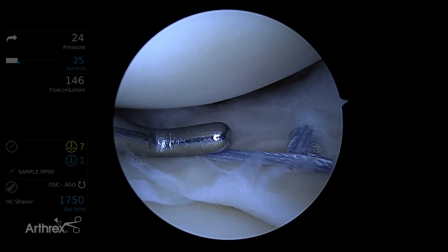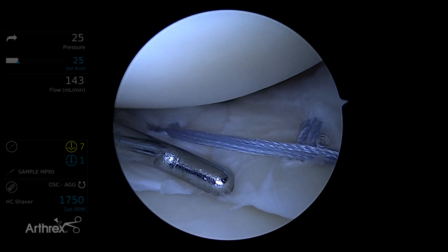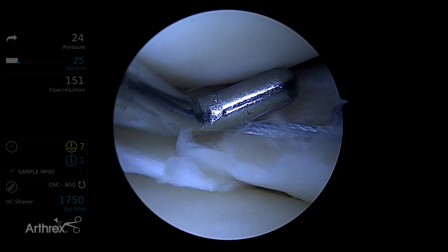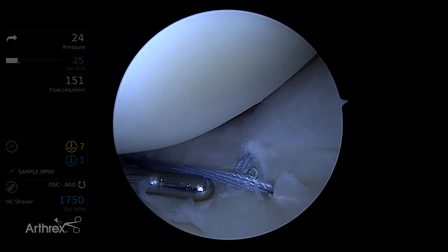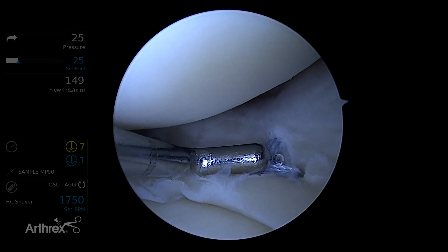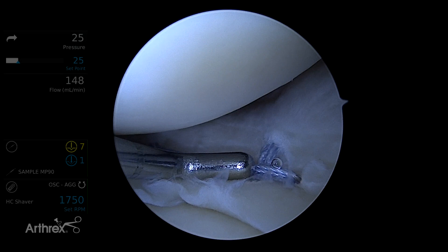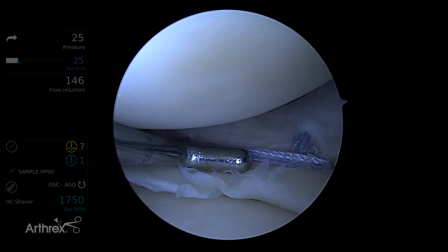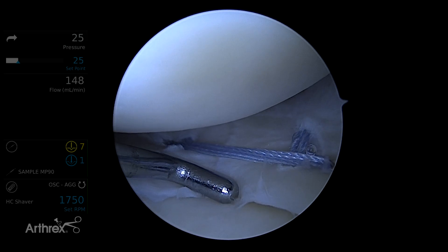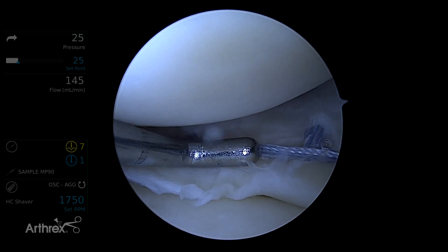Remember, we want this to heal. So whatever biologics we add into a radial tear — which most of us are talking about doing now, at least in those types of tears that are hard to heal — they're a combination of white on white, white on red, and red on red by definition. We know the thing will heal out at the base; we want it to heal at the junction. But if we have injured tissue juxtaposed to the radial tear itself, what this ripstop has done is taken up the tension so that this final repair suture is reinforced with the vertical suture in front and back. We're pulling through these handlebars and using them to take up the tension instead of ripping through the edges of each side of the radial tear. So we've got really good tension and coaptation, and we're not counting on this as the strength stitch — these vertical sutures are the strength stitches, and this is just the coaptation stitch.